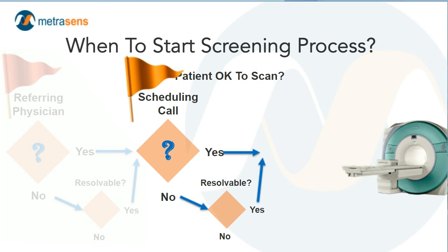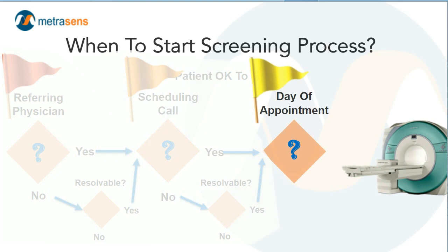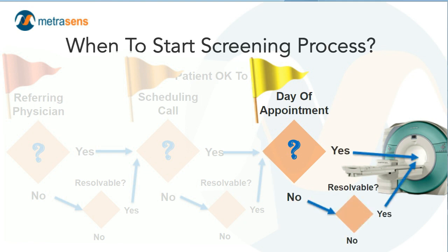Which brings us to the day of appointment. And again, the goal here is that we want the patient to show up and the caregivers to have all of the information necessary to make an informed assessment about that patient. Ideally, that informed assessment is, yes, the patient's ready for their study, let's go ahead. Or maybe it might be, oh, this is the patient who has the MR conditional implant and we need a special pulse sequence to get the SAR down below 1 watt per kilogram or whatever it is. Not a problem. We can modify the sequence. We can get it there.